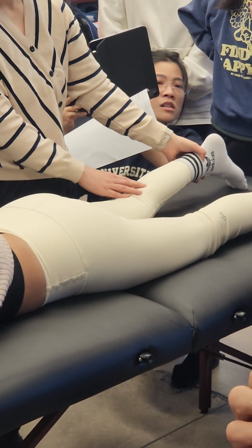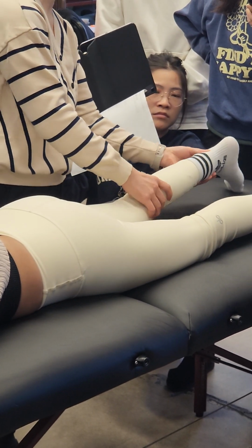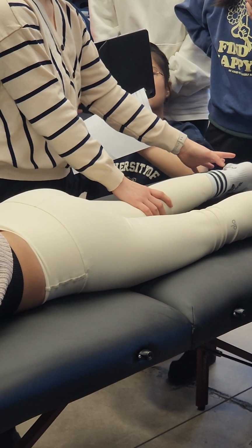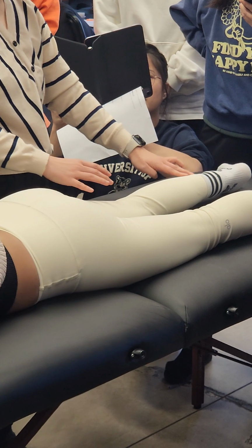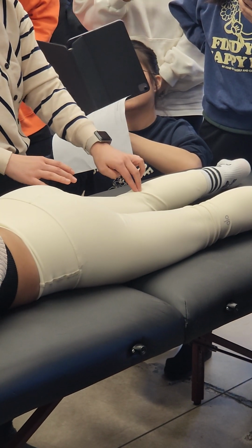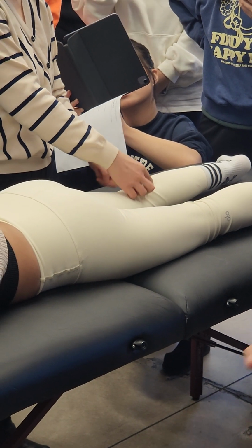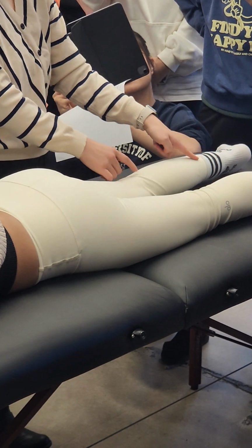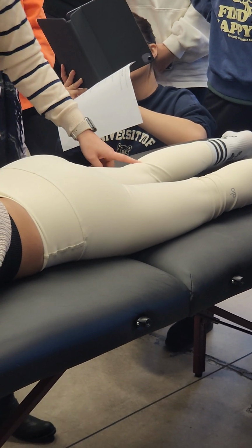And then, the small saphenous vein, we can do it in this position. The small saphenous vein comes from the lateral side of the foot, and then goes all the way up along the leg, and then it goes to the popliteal fossa and drains into the popliteal vein.